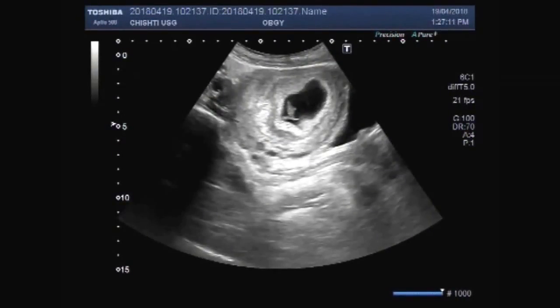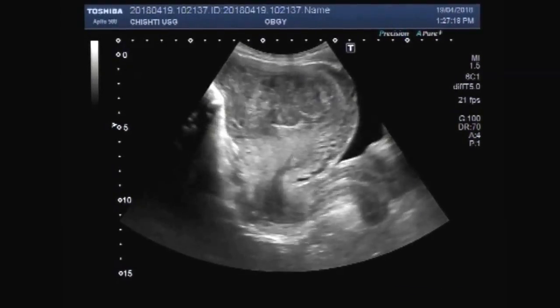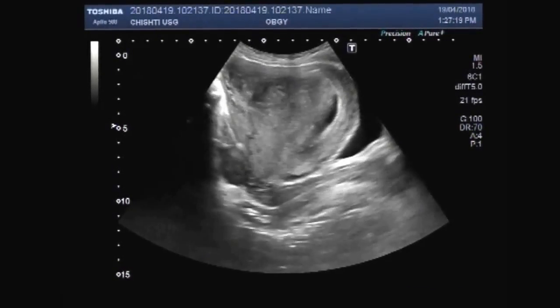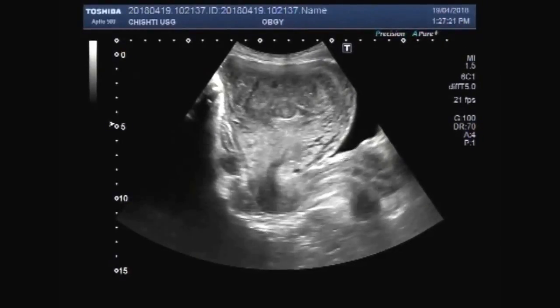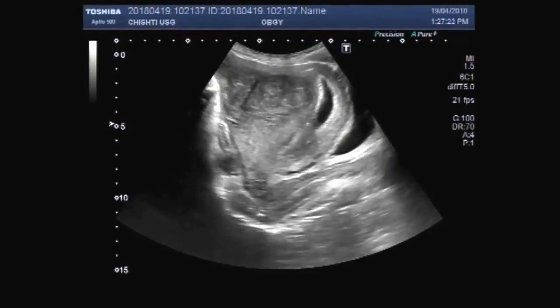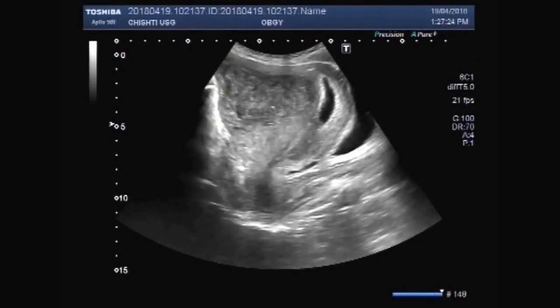Dear viewers, I hope you are all fine. This ultrasound video shows a female patient having pregnancy and a large ovarian mass — a left ovarian mass — attached to the interior wall of the uterus.